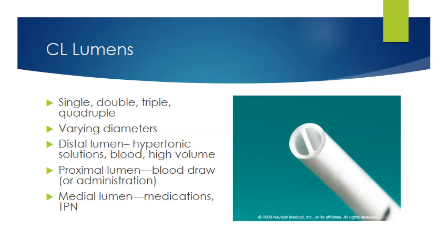And actually this one is just cut off flat, but the end tip of a central line only has 1 opening. If this were a double, the second opening would be somewhere up the shaft of that line, so that those medications never mix until after they have been in the bloodstream, so that they only mix with your blood. It's not a mixture before it hits the bloodstream. Hope that makes sense. Okay.